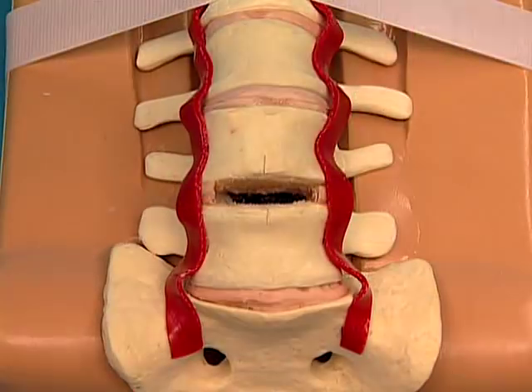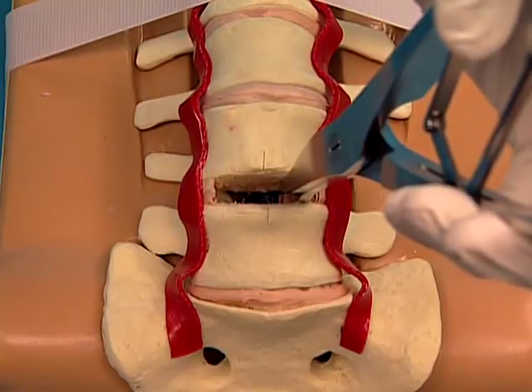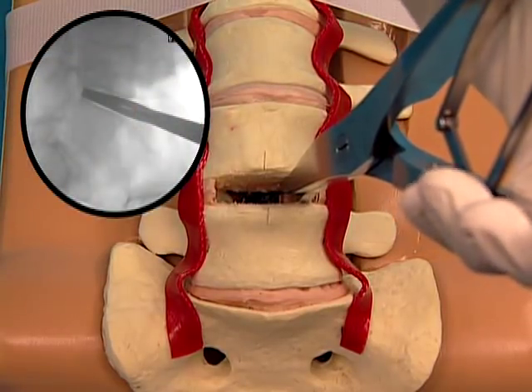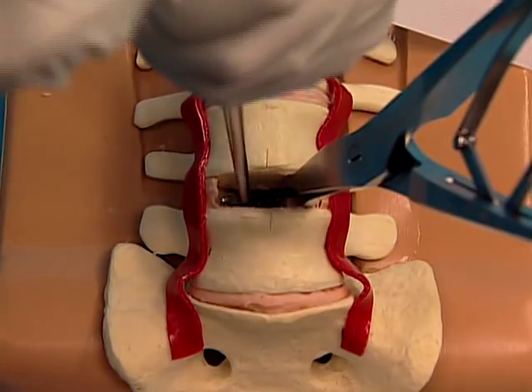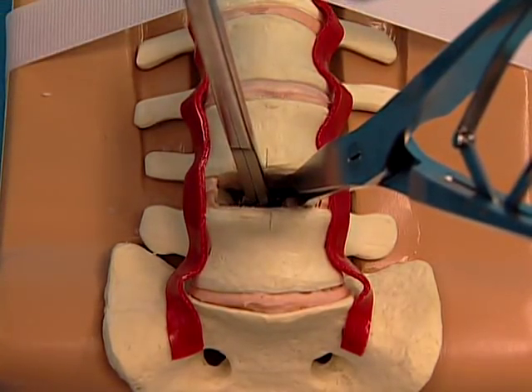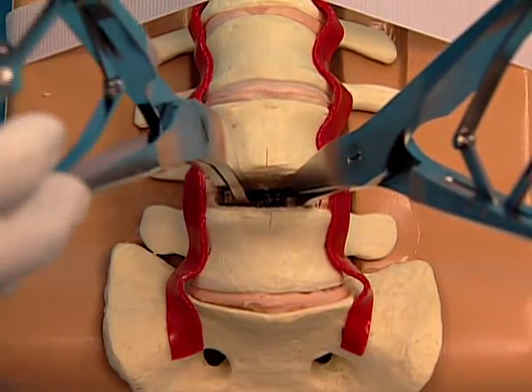Under fluoroscopic control, insert the vertebral body spreaders to the posterior margin of the vertebral bodies. Gradually remobilize the motion segment. Place the spreader on one side to facilitate the discectomy on the contralateral side. Repeat for the other side.